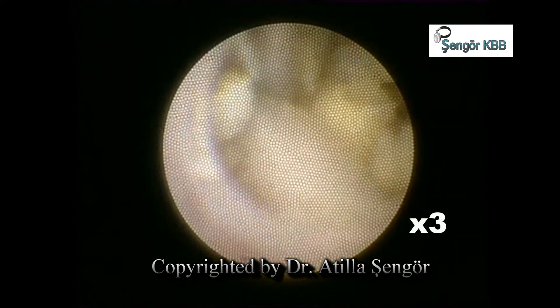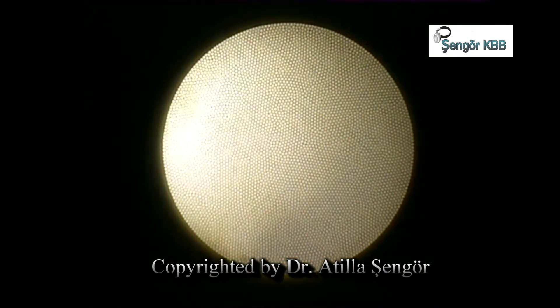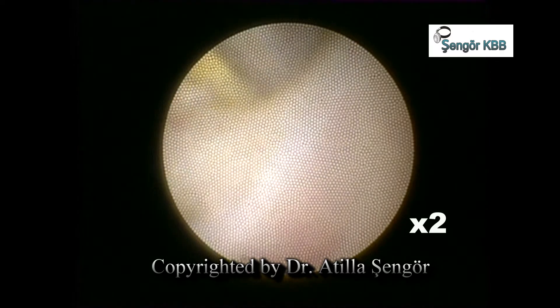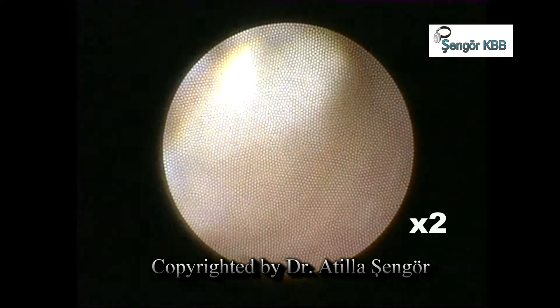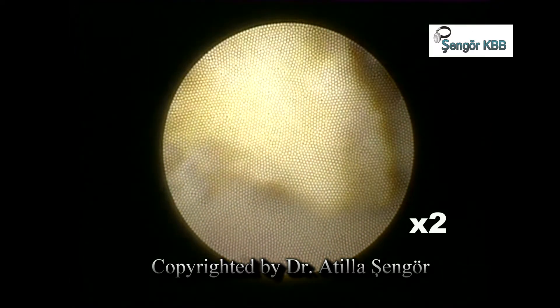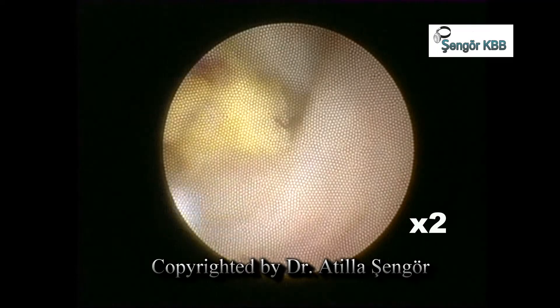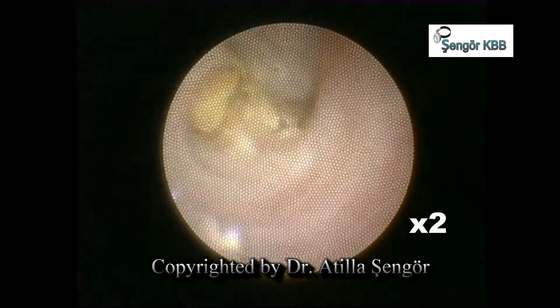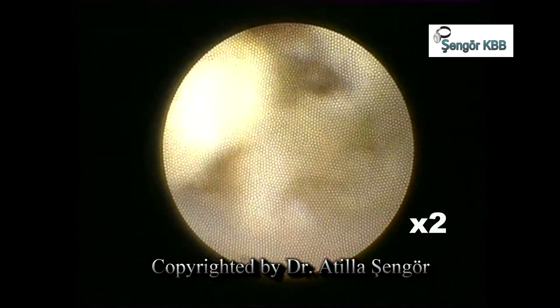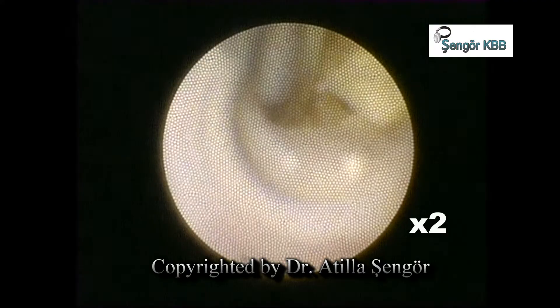Let me give you some technical information. The diameter of the salivary duct is about 2 mm. The diameter of my sialendoscope is 1.6 mm, and my fragmenting probe is 0.6 mm.